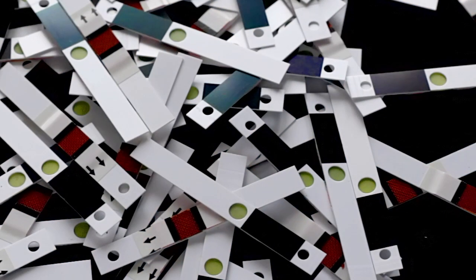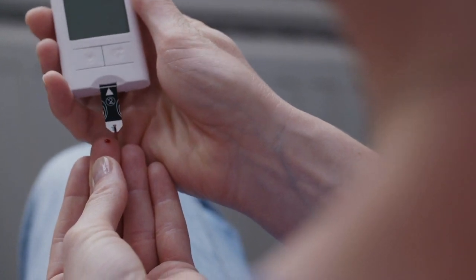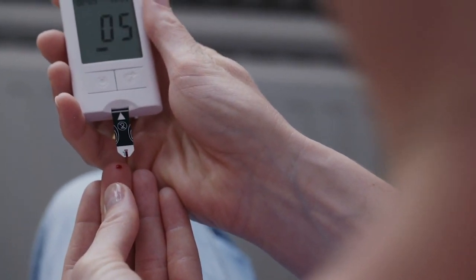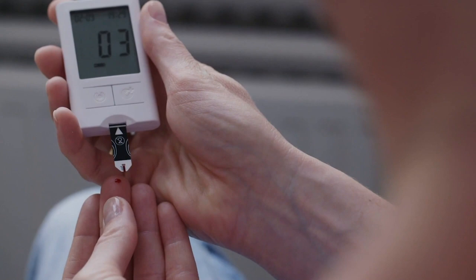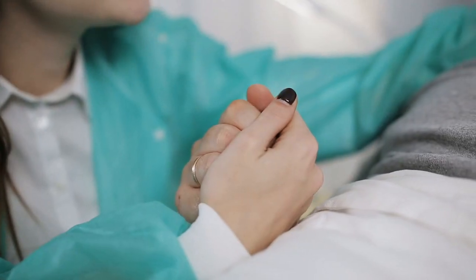Where do you buy your test strips? Inaccurate results from pre-owned or unauthorized test strips used to monitor for a disease or health condition can lead to serious harm, including death.